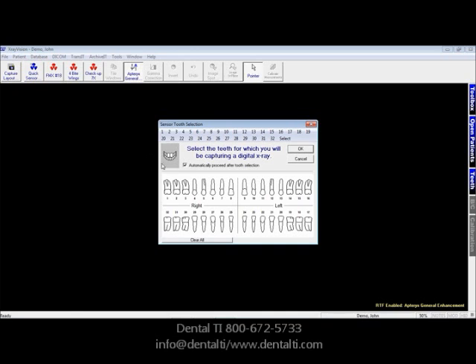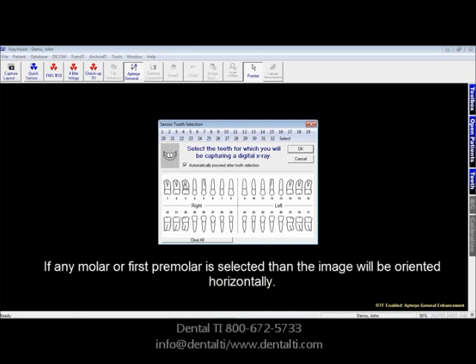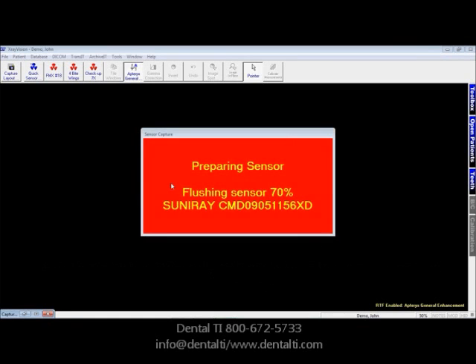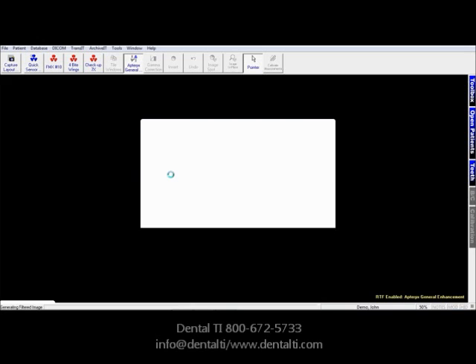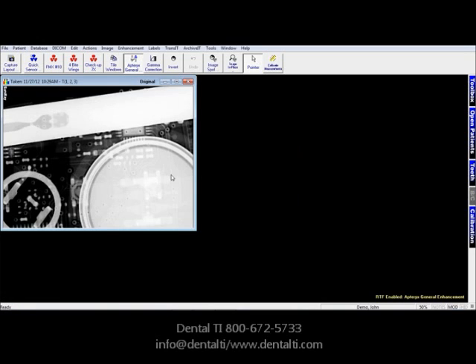Third step: tell the software by clicking the tooth number, or holding down the left mouse key and highlighting multiple teeth, what the region of interest is. The software prepares the sensor. Expose your X-ray. Here we're taking an X-ray of a key fob. You'll notice the images return properly oriented, and the tooth numbers are displayed on the title bar of the image.